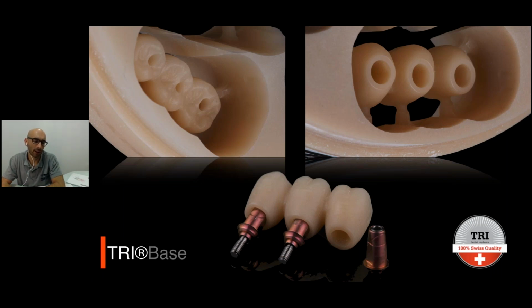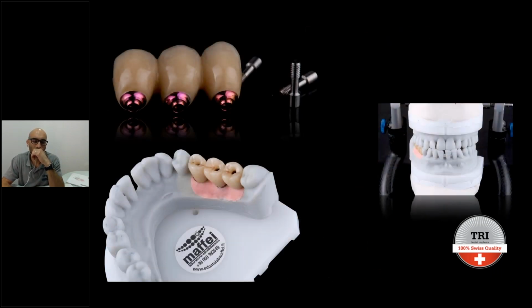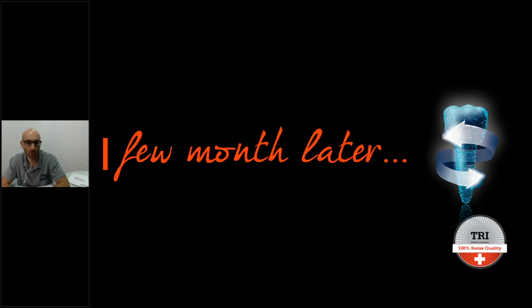And we have a perfect fit, of course, with the Ti base. In this case, we have kept the original Ti base without cutting it, because we have enough height in our restoration. And here you can see the final provisional after bonding the titanium base, and after creating the aesthetic with the composite color. So we delivered it, the doctor said okay, everything is perfect, the provisional works very well. So we have just to finish the work.